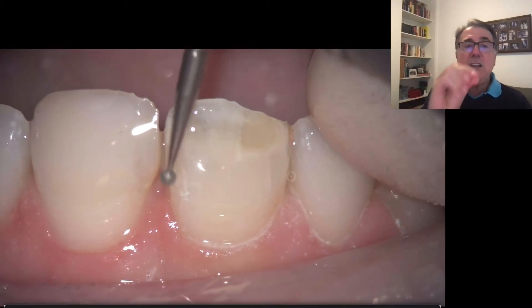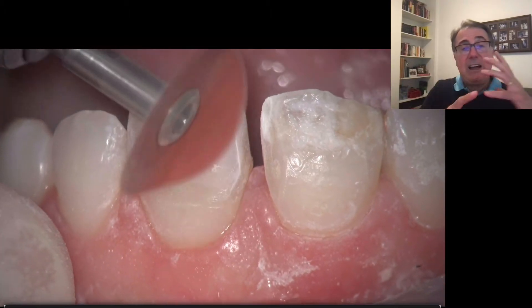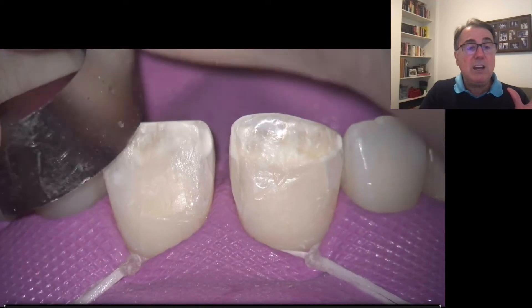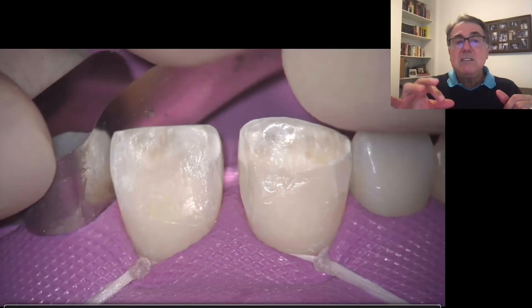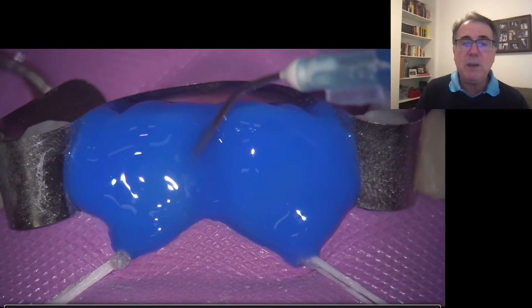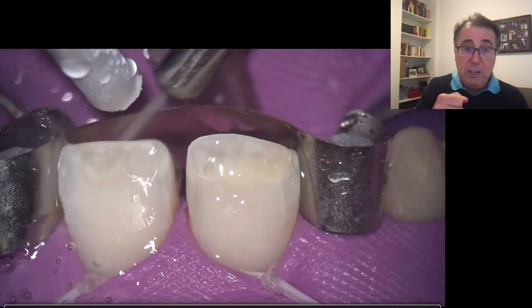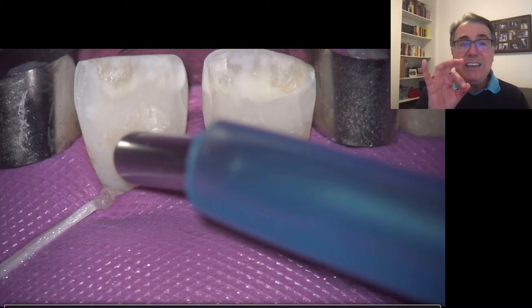There's still a little bit of the white lesion remaining — I have a little bit on the mesial also. Now I'm going to remove the composite of the other tooth, keeping changing instruments from the bar to the disc to the scalpel until I think I have everything cleared. Now I'm going to place a metal strip around those two centrals to prevent the conditioning and the adhesive from touching the two laterals. I'm going to condition all the surface of those two teeth, making sure the whole surface is covered by the phosphoric acid. After thoroughly cleaning everything and drying it out, I can see I still have a lot of composite on top of those teeth.